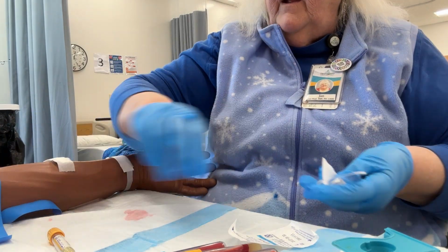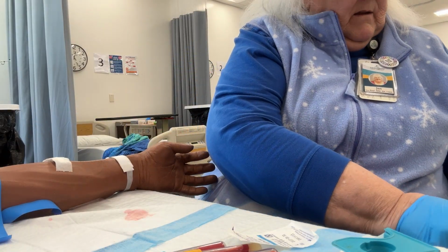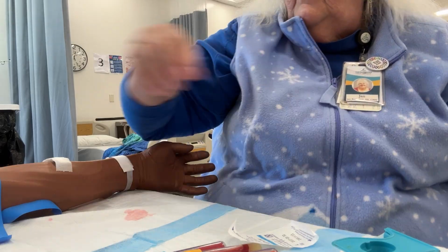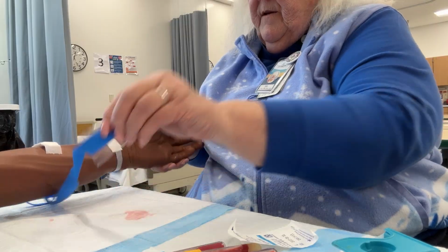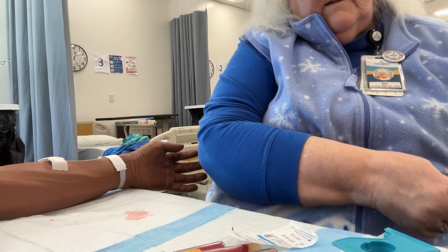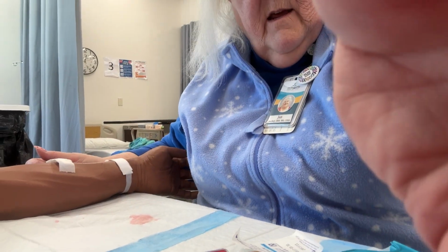Tidy up my area. Throw away anything I'm not using. Okay. Remove the tourniquet totally from under the arm. And a tourniquet is considered a single-use item. And, oops, got my hand in the way here.